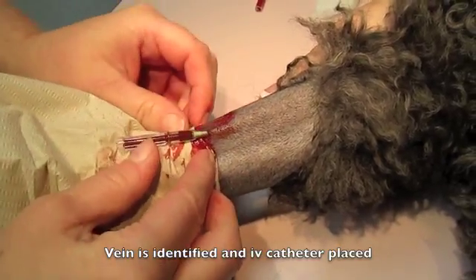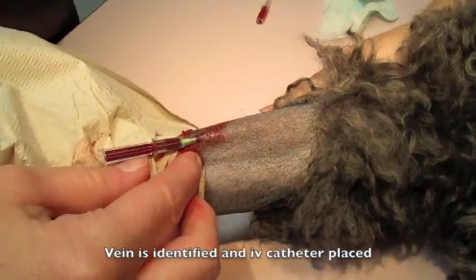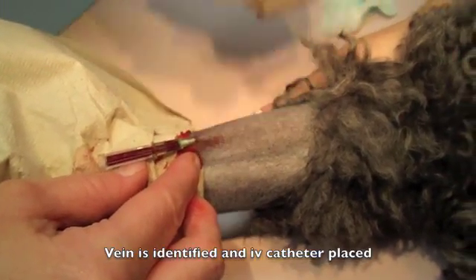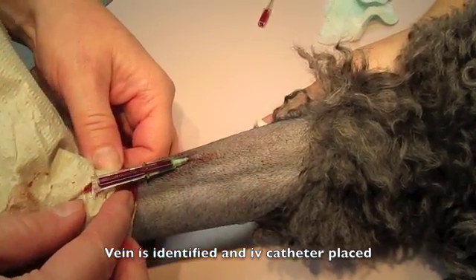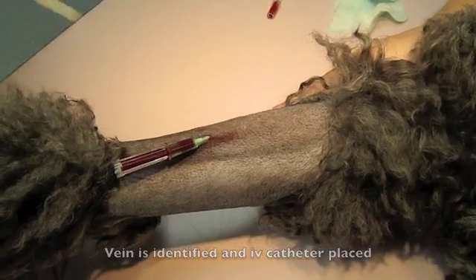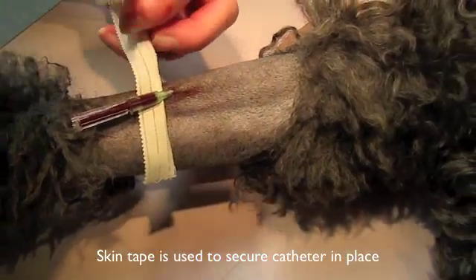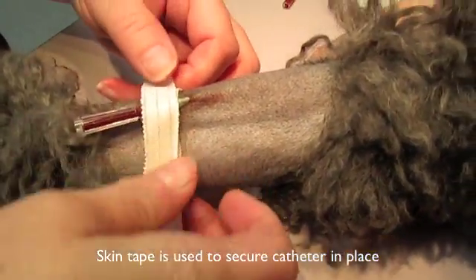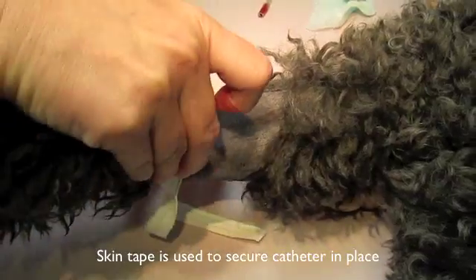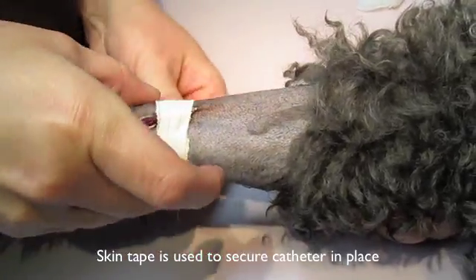She is cleaning any moisture or blood away from the catheter site, dabbing any blood away from the area. Now she is using skin tape to keep the catheter secure. Pets sometimes are nervous and move, and can accidentally pull a catheter out. This tape is placed securely to keep the catheter from moving or coming loose while it is in use.